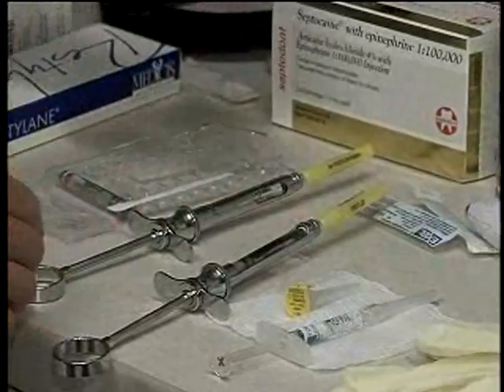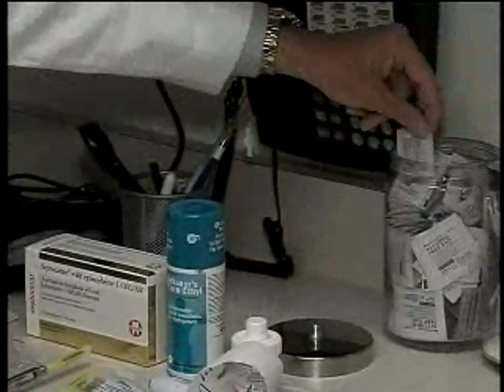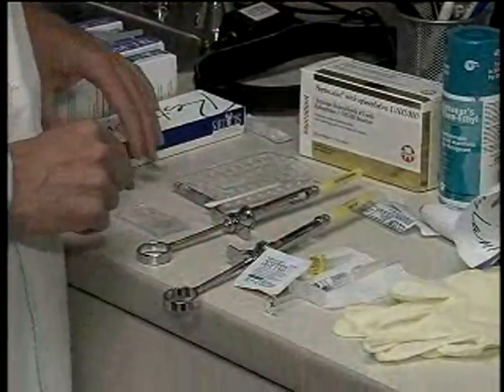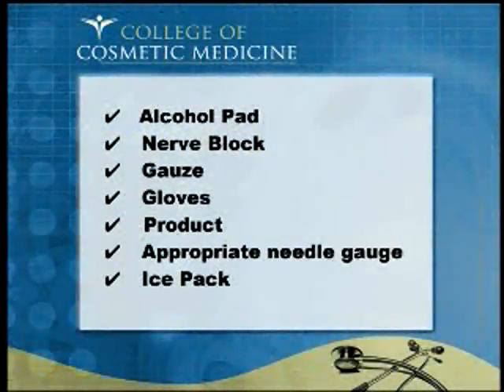So I also have an alcohol pad ready to go to clean off my patient. And we have an ice pack ready to go for after the treatment. So these are some of the things that I have ready to go prior to me treating the patient.